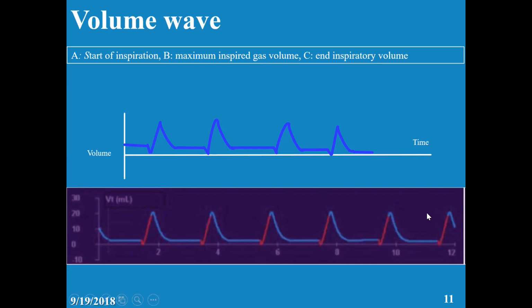Another question. If we ignore the one below, is this breath assisted, spontaneous, or mandatory?